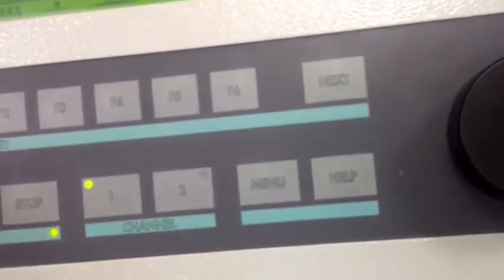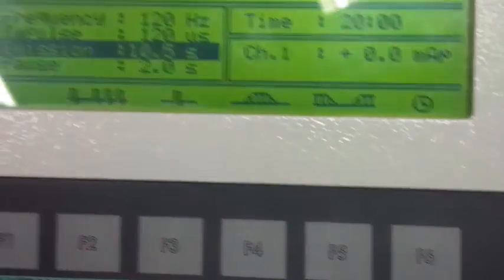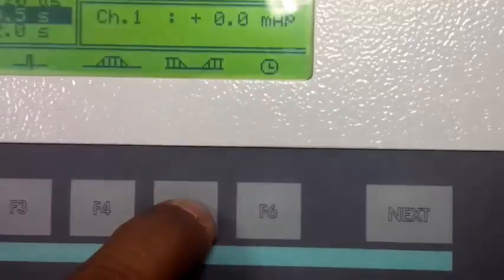Then how much rest time do I want to give? Another machine is different. Maybe some settings are more, some less, so you cannot say the same settings. What is pause here? Stop, that means rest period. The current will come, we will see now. We will not say 10-15 seconds. We will say, for example, 10 seconds. Now I want to give rest.